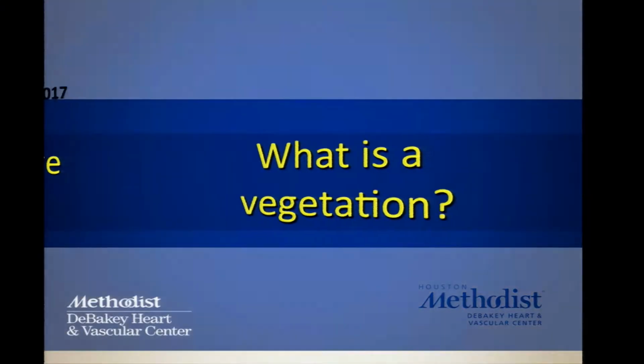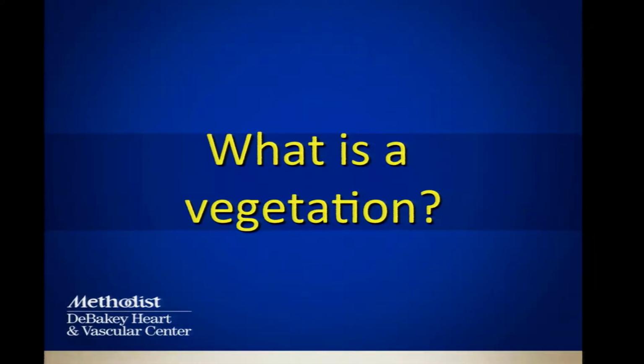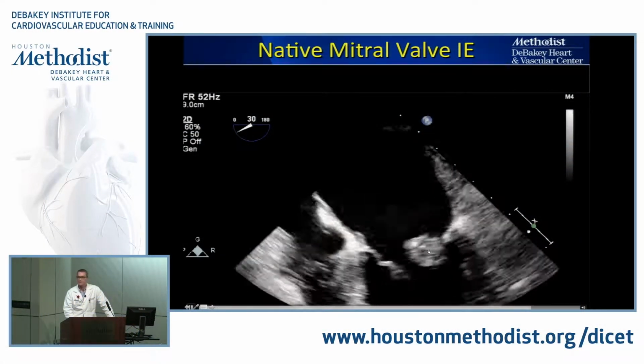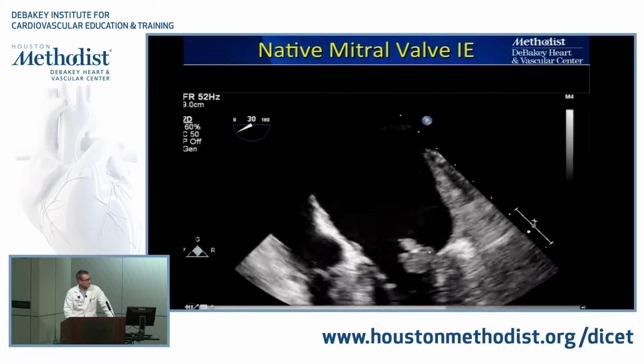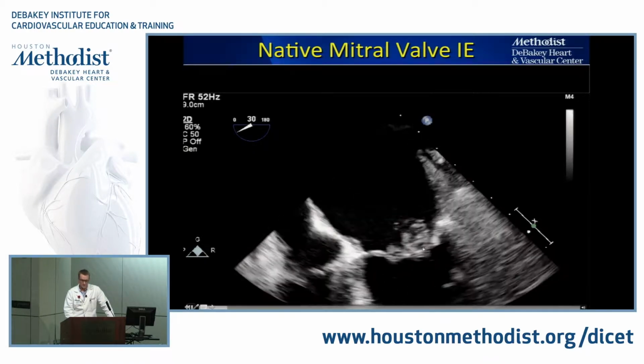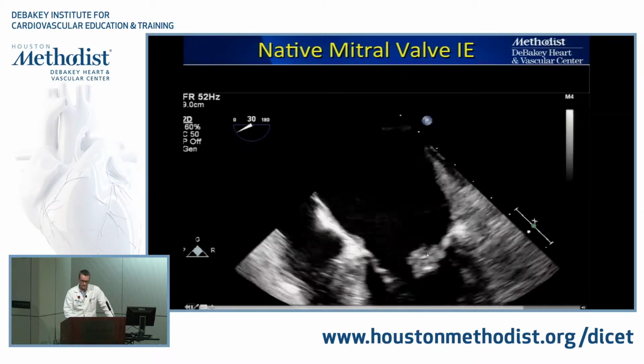All right, so what is a vegetation? That's really the first question. You hear me talk a lot about vegetation. We often call them wigglers. That is a fundamental feature of a vegetation, is the mobility. So this one meets all the criteria of a vegetation by way of example, okay? So it's bulky, perhaps. It doesn't have a uniform dimension. It's bulky at the bottom. It's linear at the top.